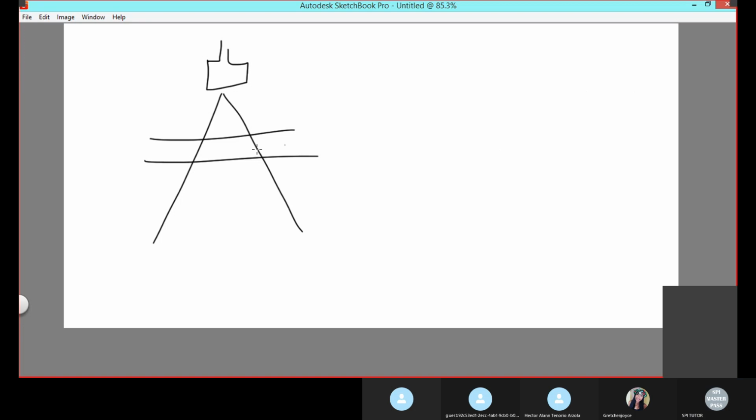Because the whole towards me and away from me kind of goes out the window. Okay, the blood is moving side to side. It isn't necessarily moving towards me or away from me, to be honest. Okay, when the vessel is completely perpendicular like this, you can argue that if the blood is moving like this, it is moving towards the transducer. You can argue that. But in that same token, I would say, well, this same blood is going to eventually go like this. And isn't that moving away from you? So you can argue any of these two, okay?